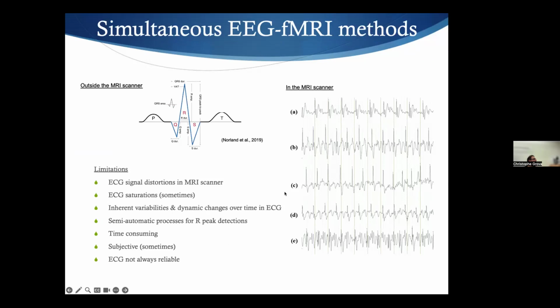But if I want to look into that, the main limitation is that when you look at your EEG, your EKG in the scanner, it might look like that, which would be just perfect. And that would be perfect for AAS methods or OBS. But sometimes it looks a little bit more like that. And then you are a bit stuck.